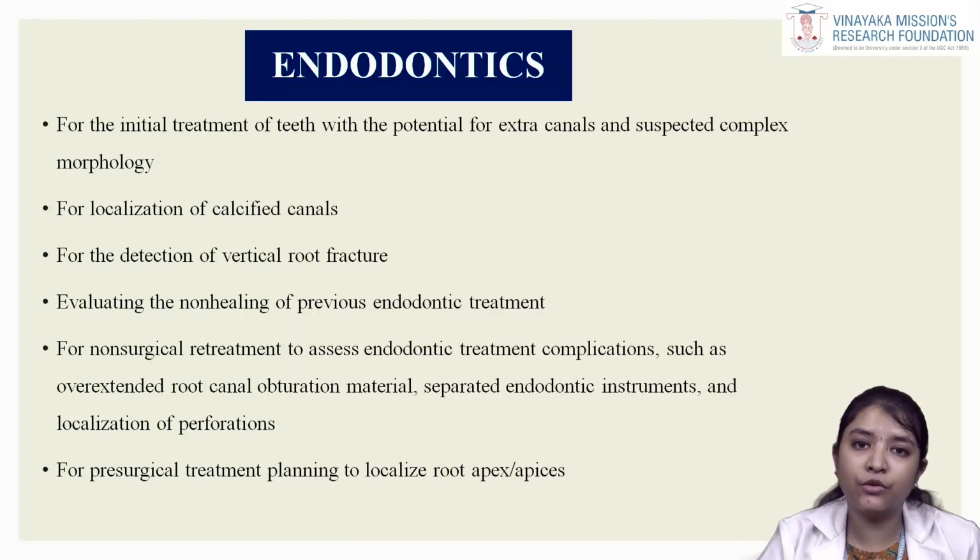Endodontics: it is used for detecting any extra canals, calcification or vertical fractures, or even non-healing in previously endodontically treated patients, and in case of any endodontic instruments or overextension of the obturation. Pre-surgical treatment planning can also be done in CBCT for endodontic purposes.